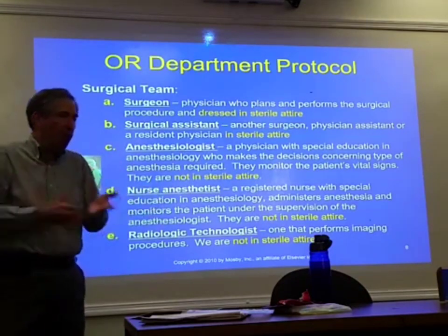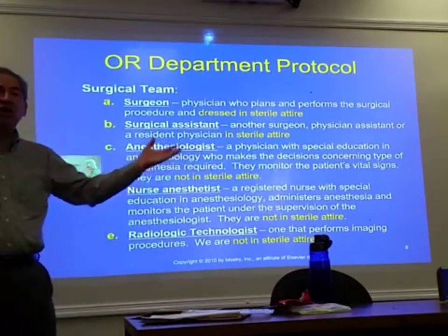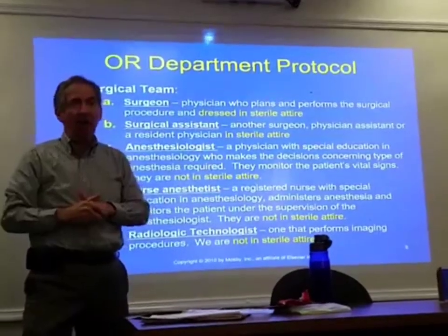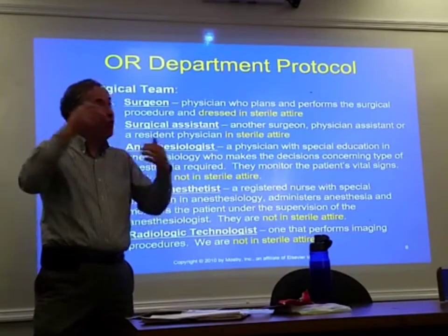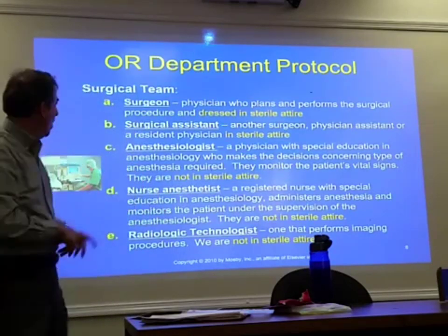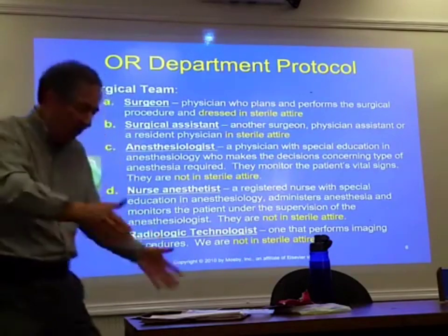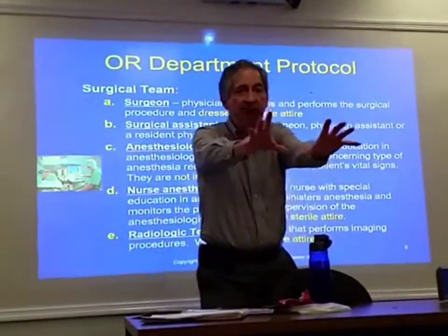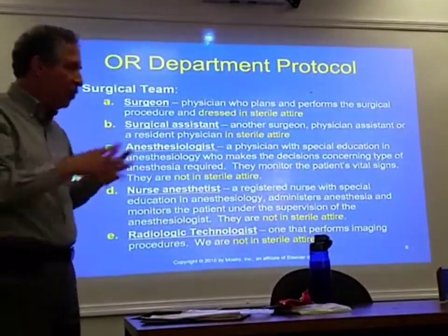They can help you when you come in the room, the patient's draped, you're shooting a cross-table lateral lumbar, and you have no idea what technique to use. They can say, oh yeah, he's 6'2", 180. That gives you an idea of how big they are. Don't just go by weight, you have to go by height too, because if they weigh 180 and they're 5 feet versus 6'3", it's going to be a different body habitus, okay? They can also help you position the C-arm when you're coming in. They're at the head end of the table and we're at the worst position at the side, which is really hard sometimes to see how far in or out you need to go. Sometimes they can say, yeah, move it in a little bit, that sounds great.